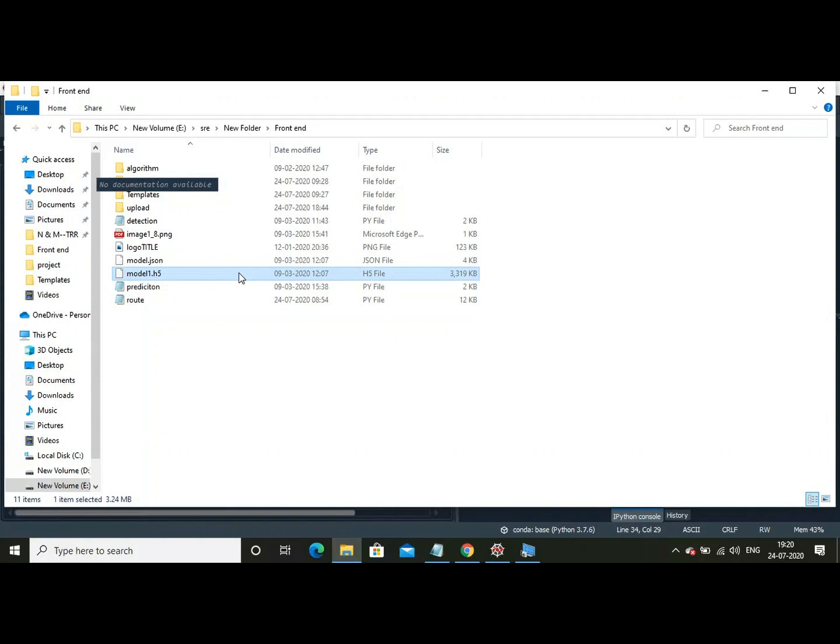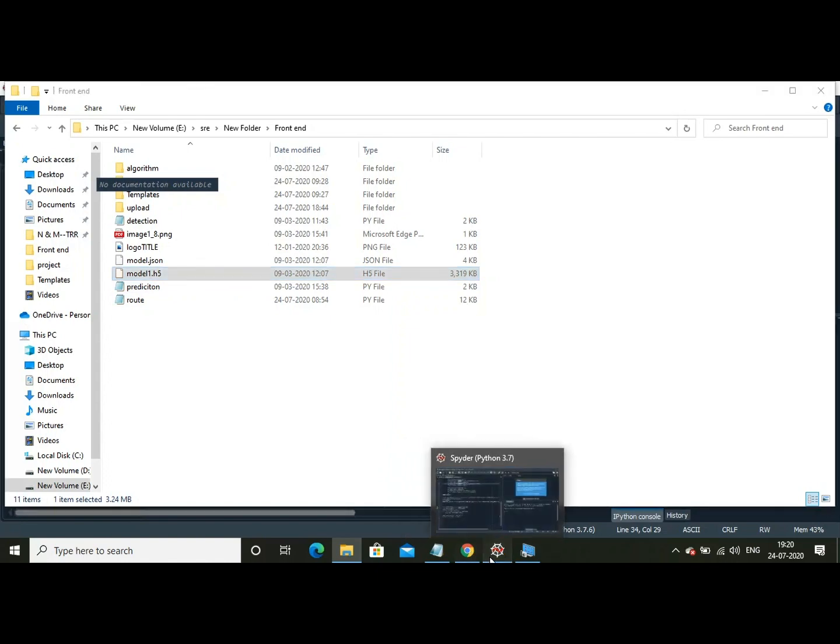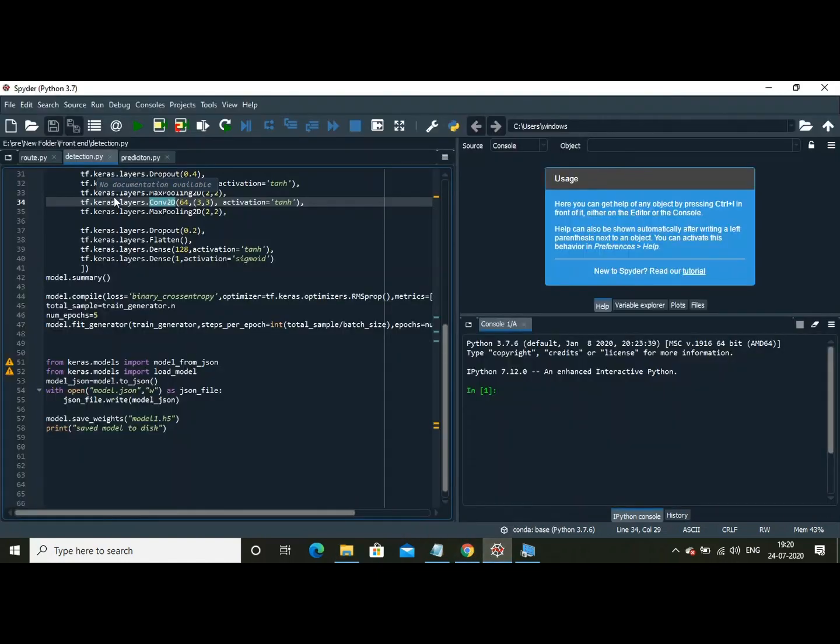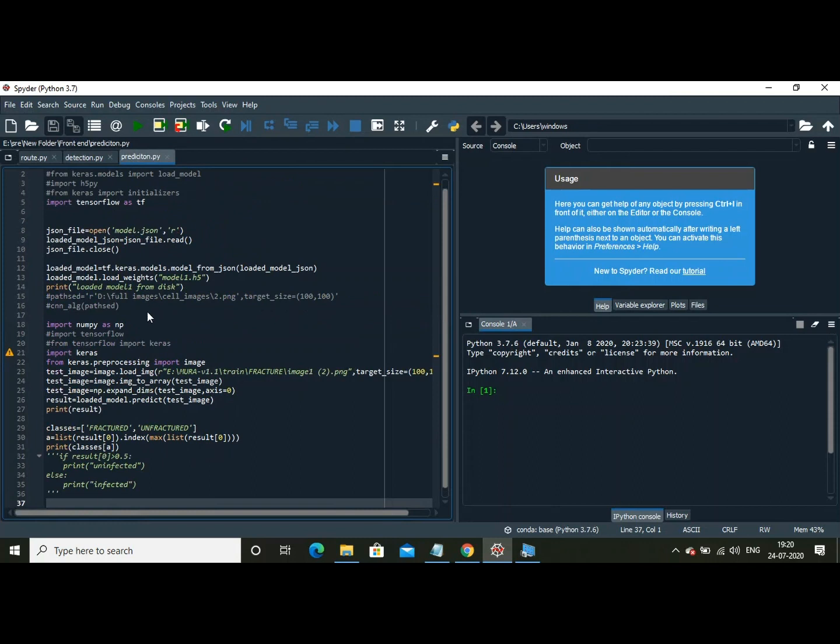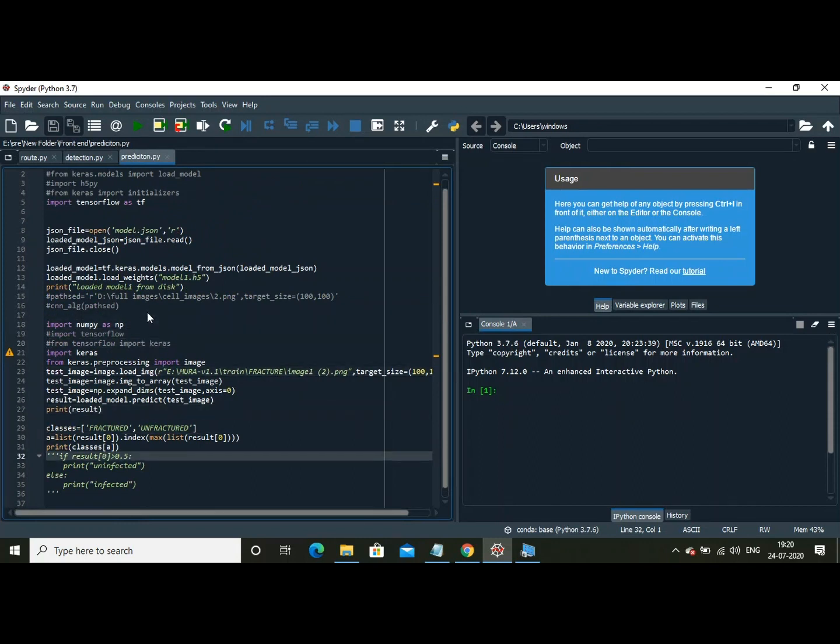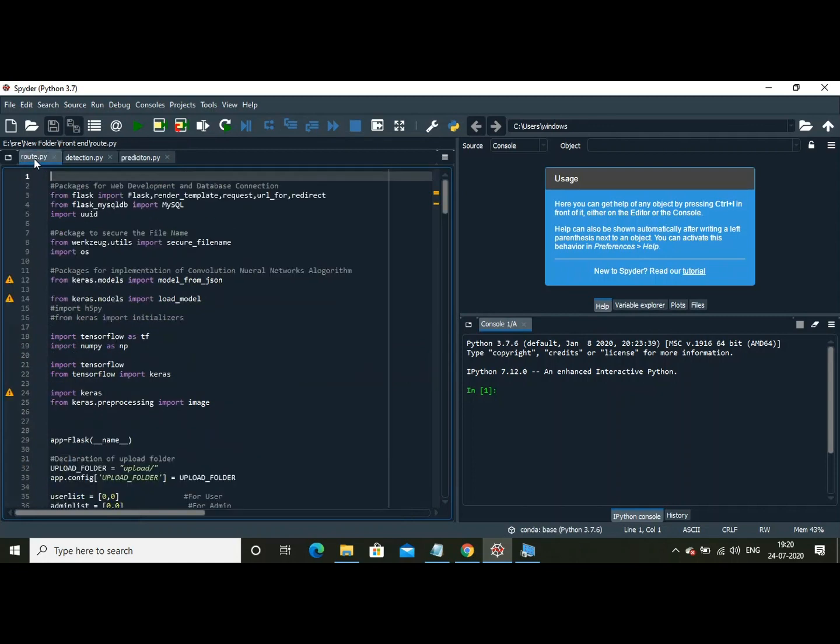Now let us see how the code predicts the result of an X-ray. This is the code that predicts the result of an X-ray. It is this code that I have integrated into the Flask route.py file. Now let's test this application by running this.